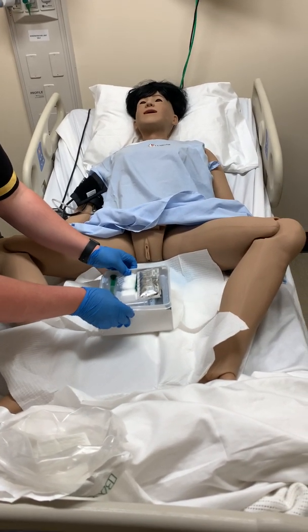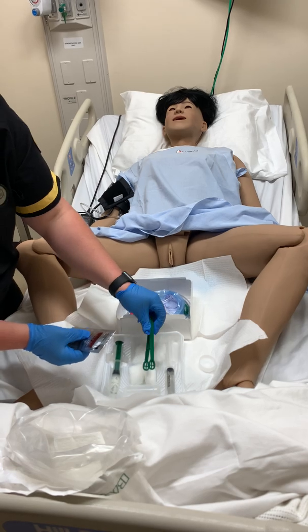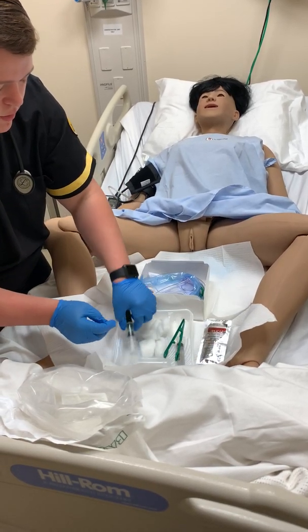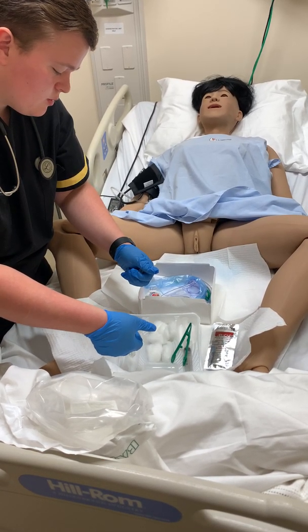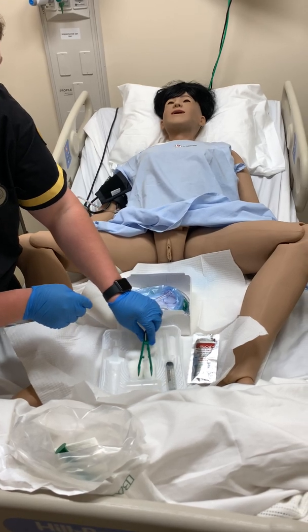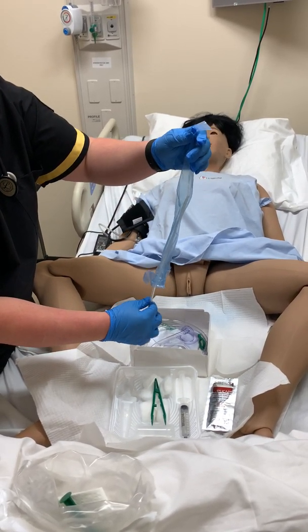Alright, so we're going to go ahead and start off with our iodine solution. What we're going to do is squirt that onto the cotton balls. That's going to allow for antiseptic. And we're going to go ahead and get our lubricant and squirt a bit down here into the container. And trash that. Alright. And now what we're going to go ahead and do is discontinue this.